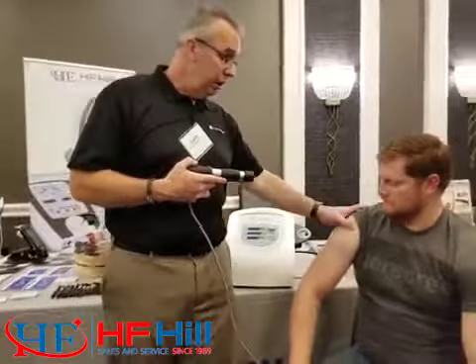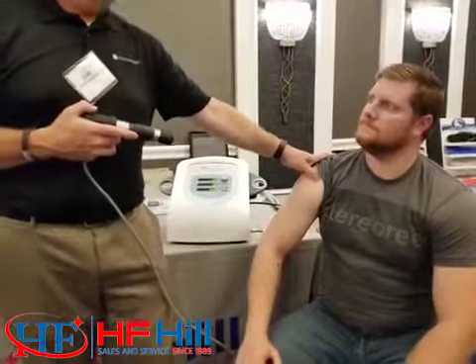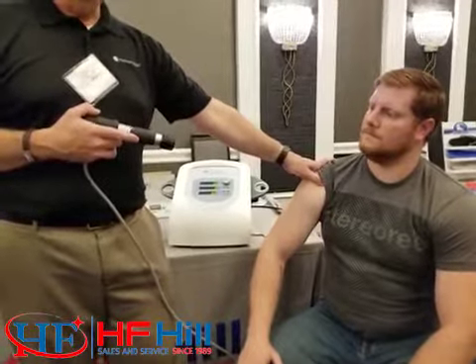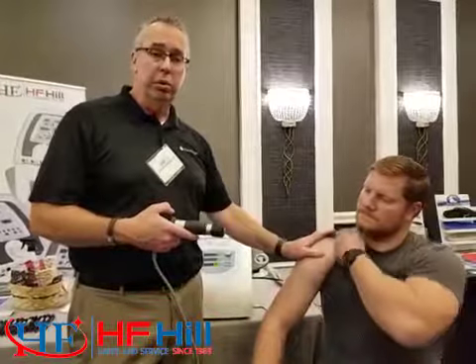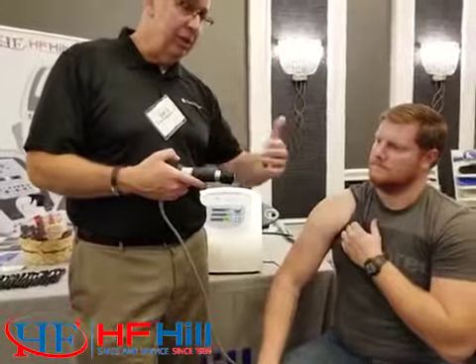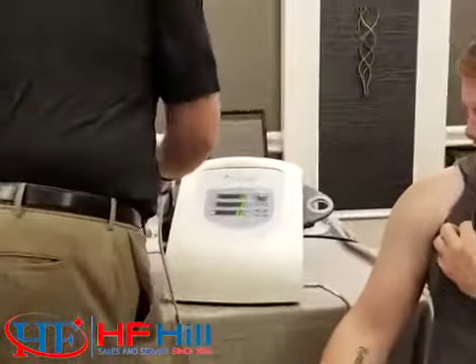So we're looking at Bryce's shoulder here, and we're going to say that maybe he has a shoulder impingement, a chronic condition, possibly associated with some scar tissue formation in the long head of the biceps that runs through the bicipital groove of the humerus. I'm not going to get to that with my thumb or even any tools without having to really dig in there. So this, with its repetitive nature, creates that transition of acoustical energy into mechanical energy.